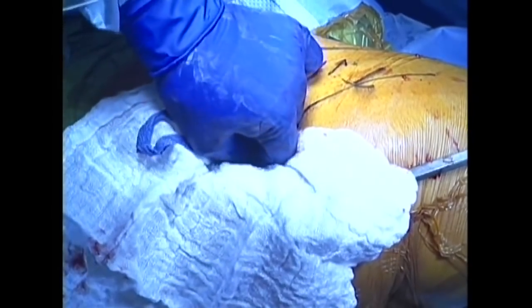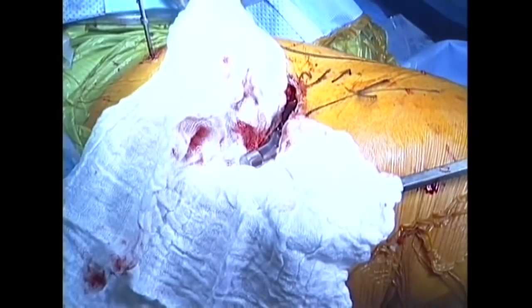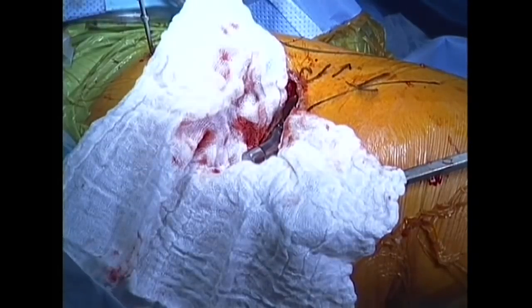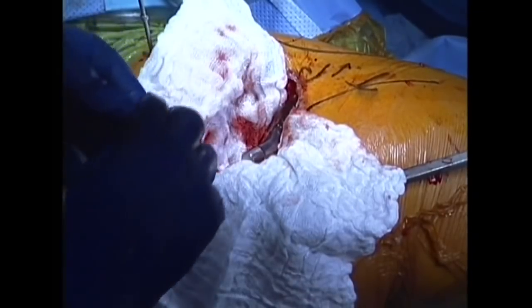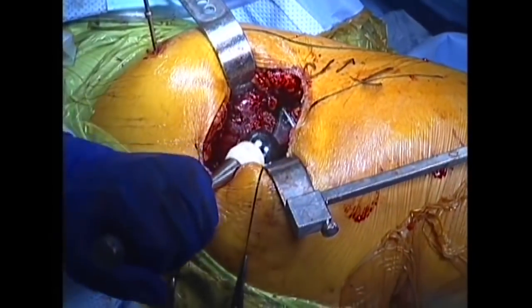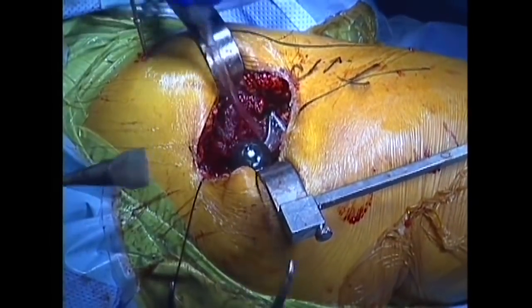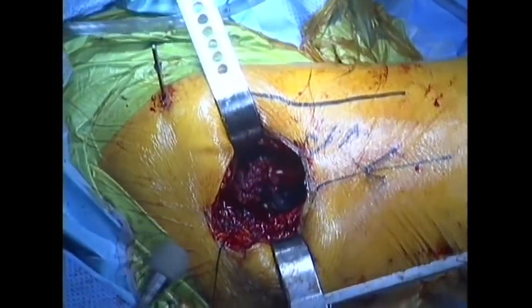The femoral head component is cleaned and dried before placing the femoral head, or ball. The ball is impacted onto the stem — in this case, it is metallic with an oxinium surface. The hip is then reduced into its final position, and the ball now articulates with the liner of the socket.